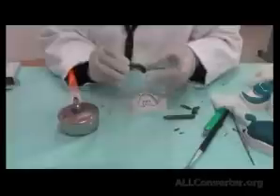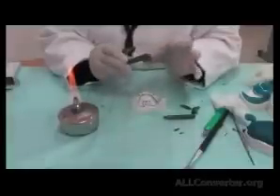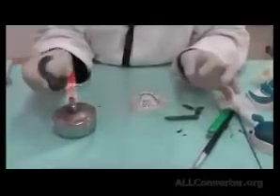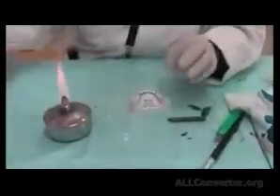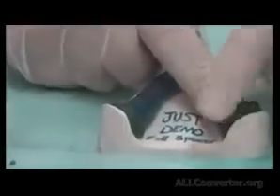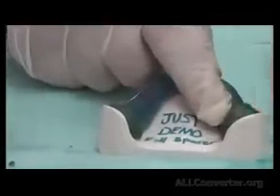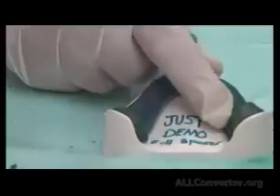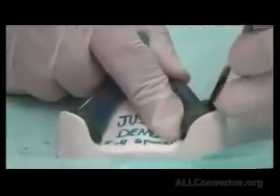Manipulate it with my finger, shaping it. Giving it the final brush of heat. Cool it down in warm water and go to the patient's mouth. Press it into location. Asking the patient to open widely. Open widely, please. Go to the left and right with your mandible, and taking out excess, in my case here.